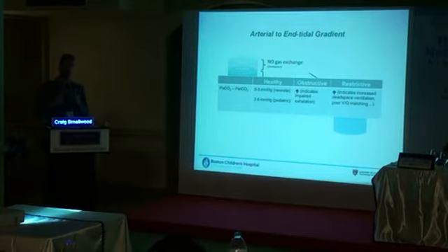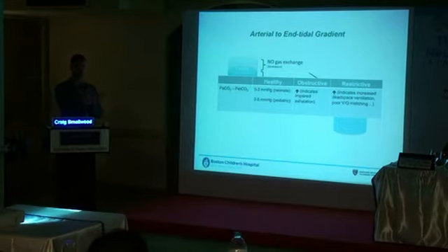One of my pet peeves, as a researcher who spent a lot of time thinking about these things, and also an RT working with clinicians and physicians at the bedside, is when people say that the end-tidal CO2 does not correlate with the PaCO2. Well, in the purest sense, they always correlate, but what changes is the proportion of dead space.